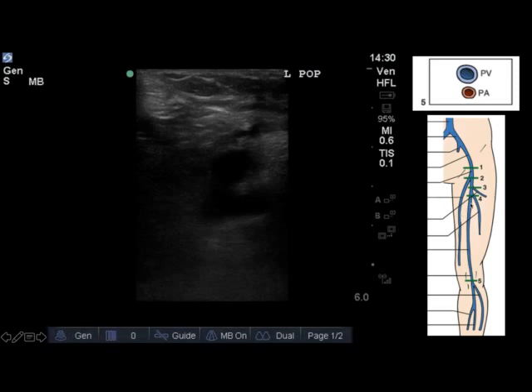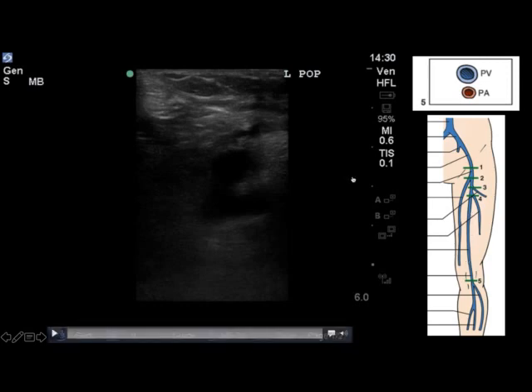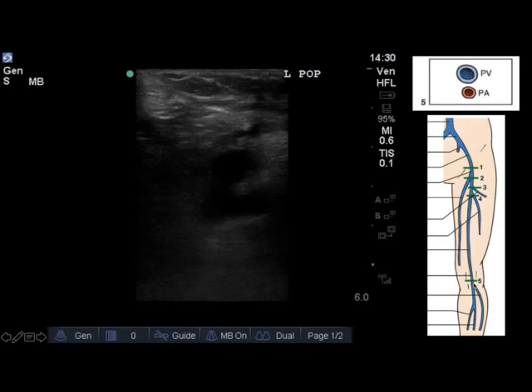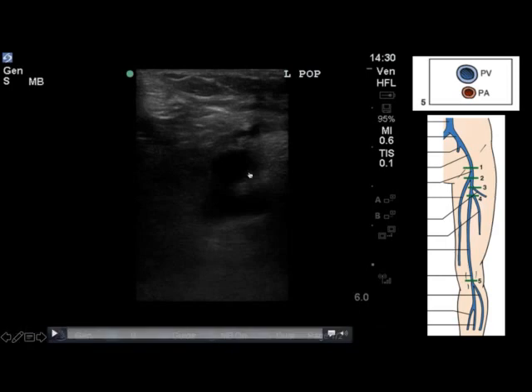Again, you're going to move all the way along every one to two centimeters, compressing and examining the superficial femoral vein, until you come to this fifth and final key point of vascular bifurcation where we're going to look at the popliteal artery and popliteal vein.